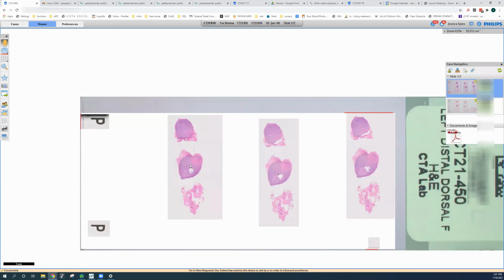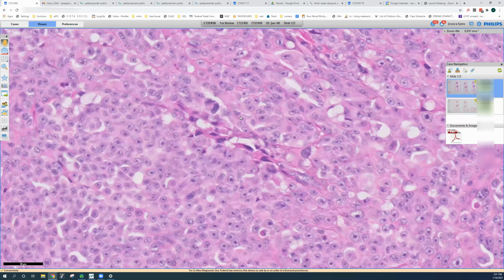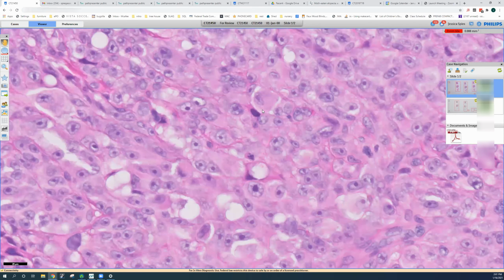You can see these epithelioid cells and these confluent nests and sheets. No melanin. Actually, this was completely amelanotic. This almost looks like a Hodgkin cell here with these two nuclei facing each other with the big nucleoli. Look at the pleomorphism of these cells and the huge nucleoli.